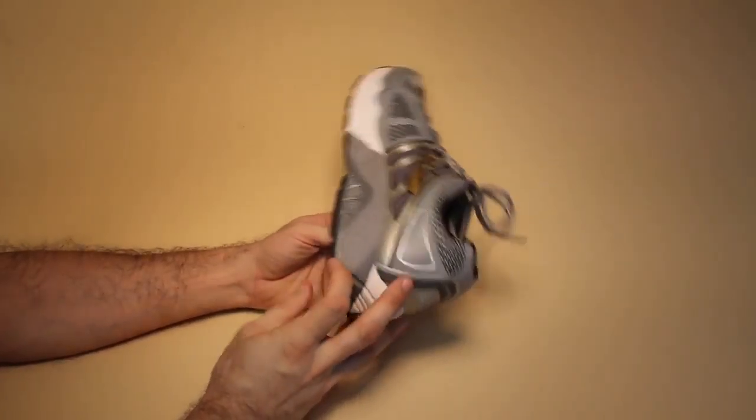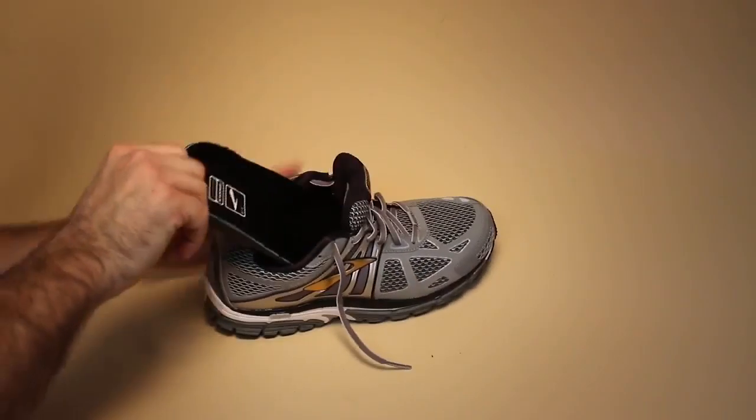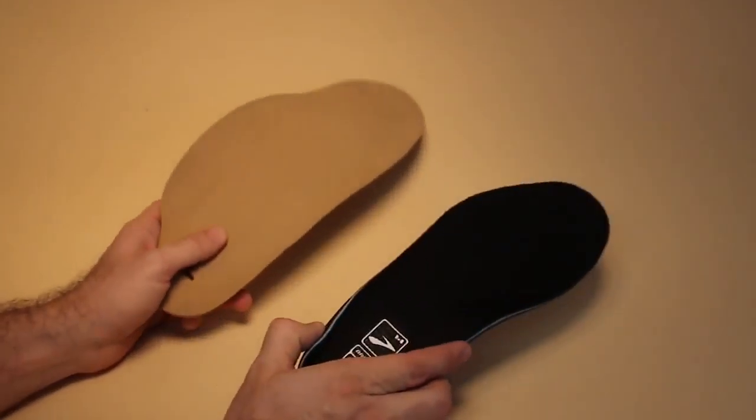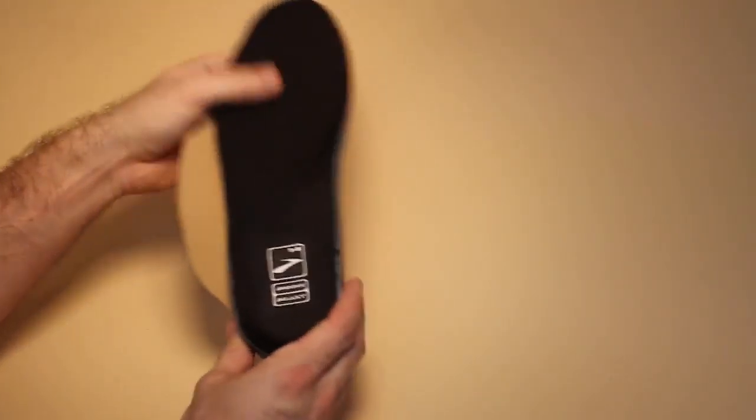Ideally, shoes that will receive the orthoses need to be in very good condition. New shoes are preferable. Shoes should have a removable insole, and the native insole should be removed. The insole of the target shoe should be approximately the same length as the orthoses or slightly larger.